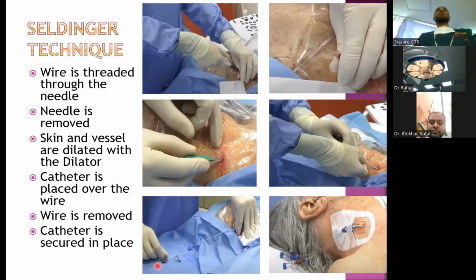Then the dilator is removed here, and the catheter is placed over the wire. After the catheter is placed, the guide wire is removed and the catheter is secured in place.